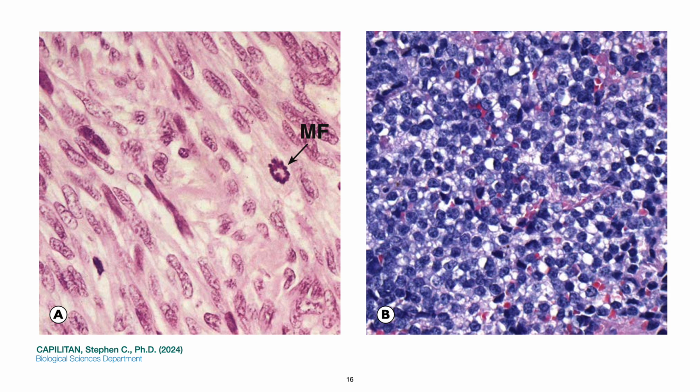Letter B shows a typical Ewing sarcoma. The malignant tumor typically arises in the medullary cavity of long or flat bones in children, though the cell of origin is unknown. As shown here, the tumor consists of sheets of small round cells with a glycogen-rich cytoplasm. It is very clear on the standard H&E staining.